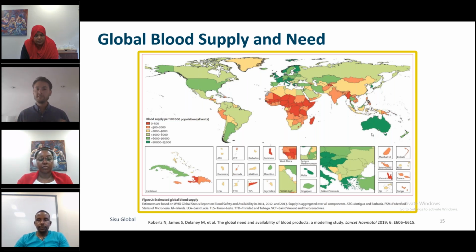2, there's also a significant risk to donor blood. While there have been great advances made in the last 50, 60 years to do on testing, cross-matching, etc., every country has the same issue of not being able to test for every disease, every possible disease. So there is always the risk, whether you live in the United States, or you live in China, or you live in Brazil, that there is a potential for disease transmission through donor blood, as well as by getting somebody else's blood, even typed cross-matched and disease-free, there is the potential for transfusion-related complications.